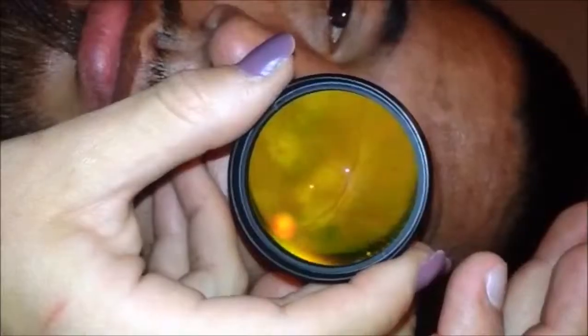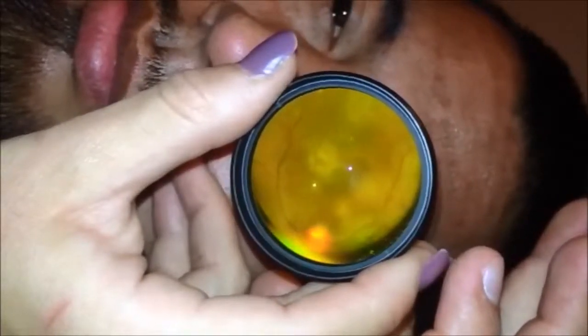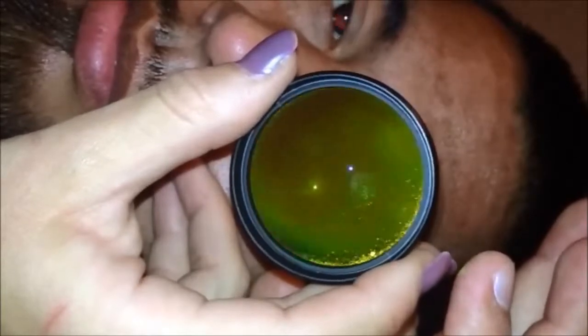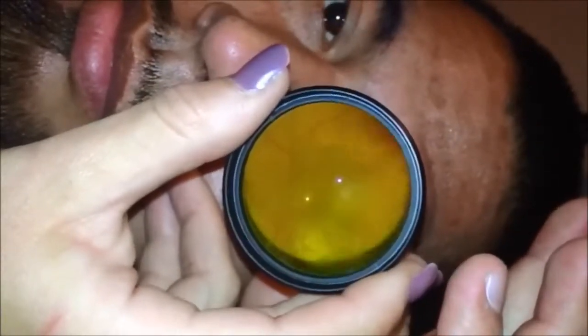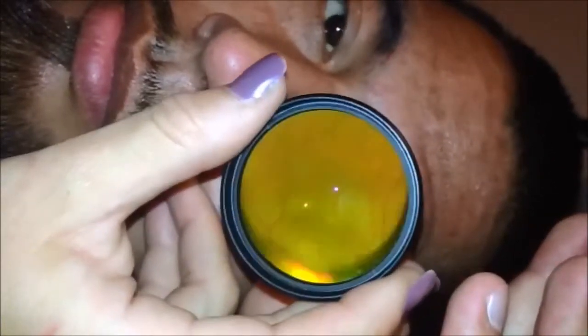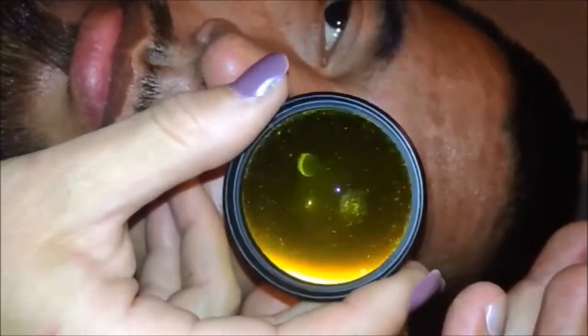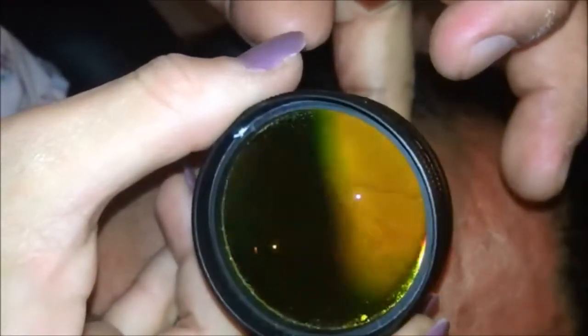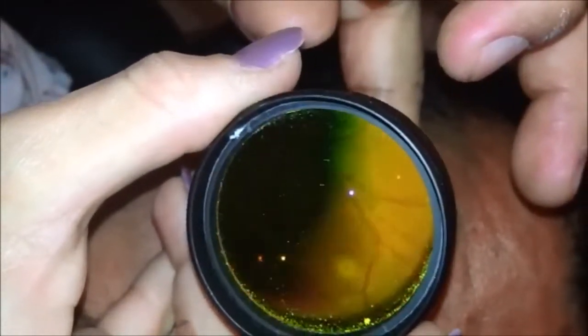But not only the posterior pole is important. You can ask the patient to change the position of their eye to enable a more thorough evaluation. For example, in multifocal central serous retinopathy, you can determine the extension of the serous retinal detachment, as well as fibrinous deposits or retinal scars location.